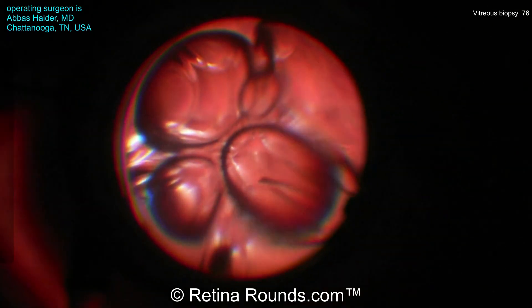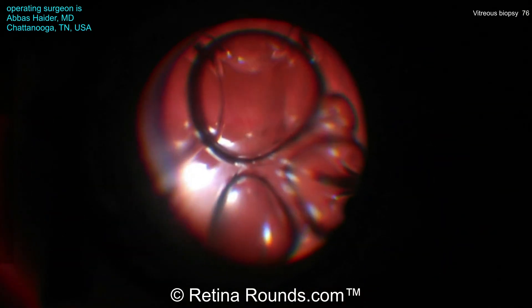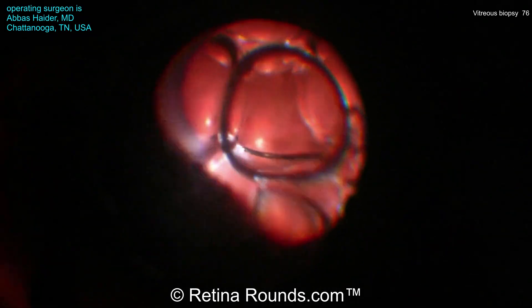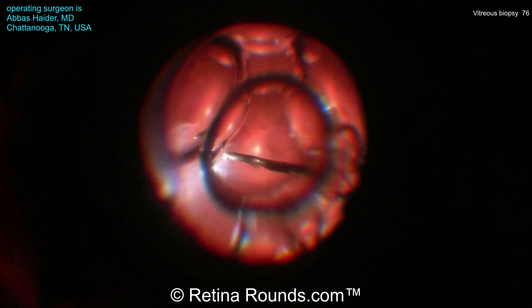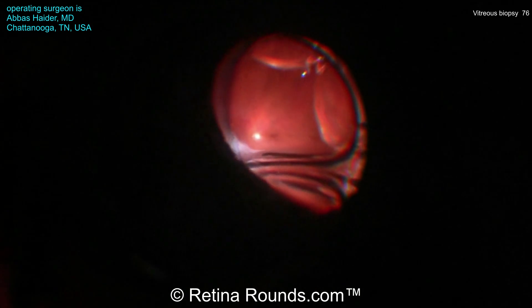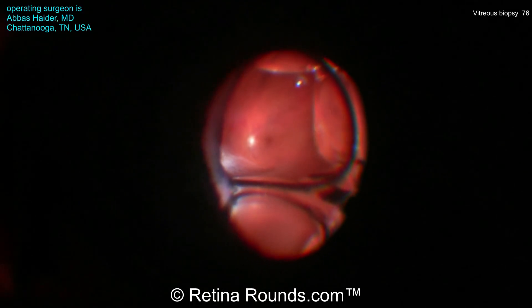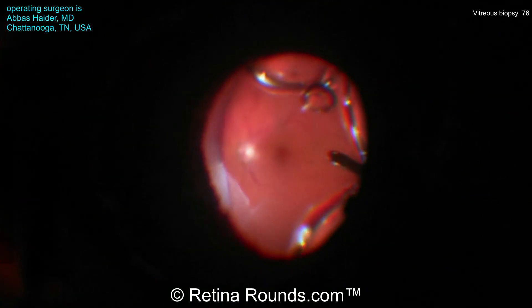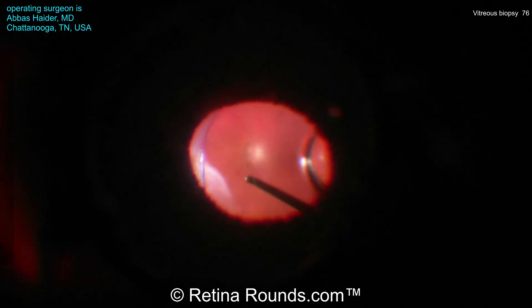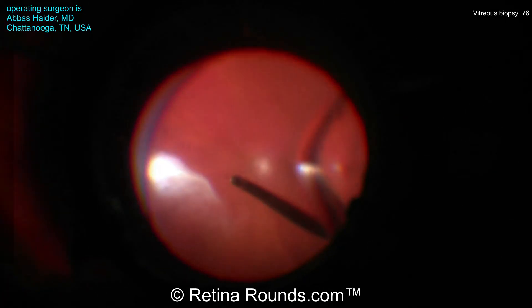The syringe can then be transported to pathology for further analysis depending on the suspected etiology. This may include cultures, stains with microscopy, PCR, cytokine analysis, immunohistochemistry analysis, and/or mutation analysis depending on the etiology suspected. Once the undiluted vitreous specimen has been obtained, vitrectomy can then be continued with BSS infusion and the vitrectomy cassette containing vitreous washings can be sent for further pathology testing including flow cytometry.